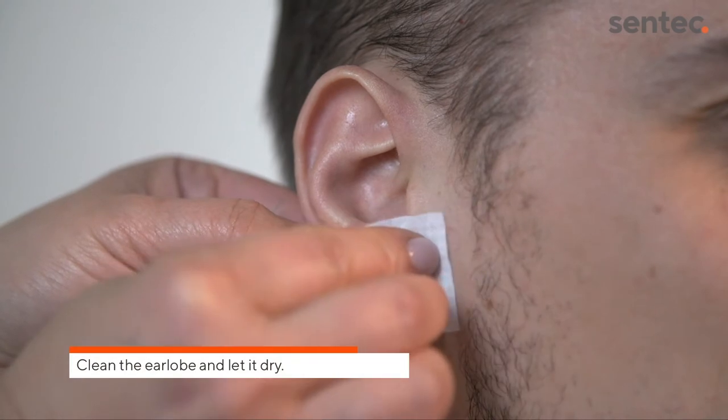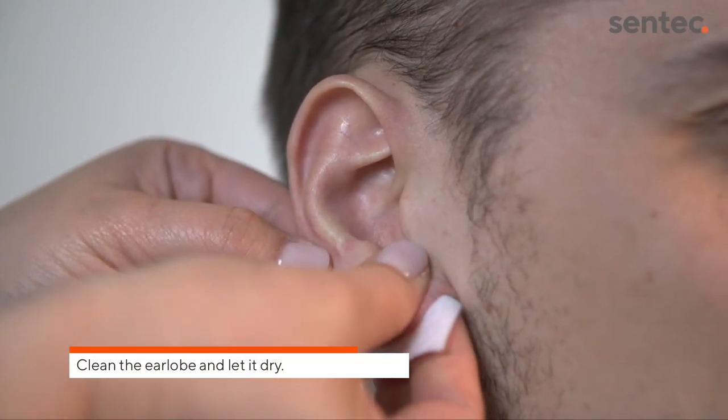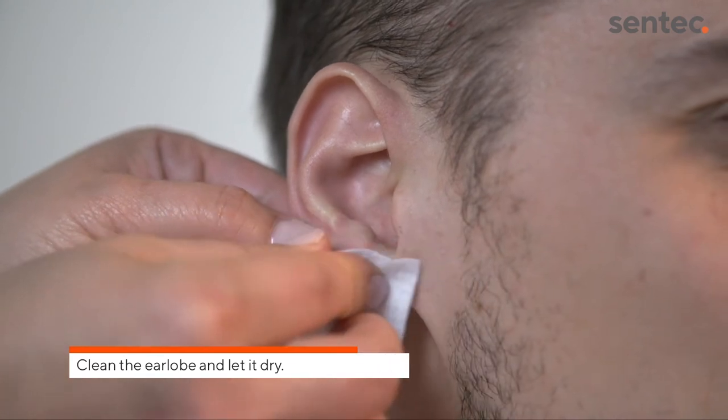Clean the earlobe with a swab wetted with 70% isopropanol and let it dry. If necessary, remove any hair.